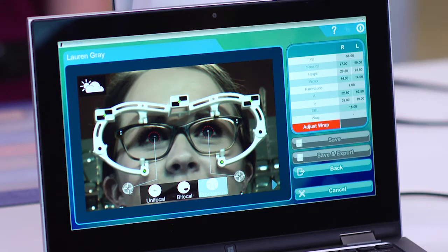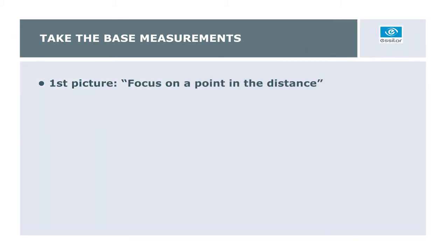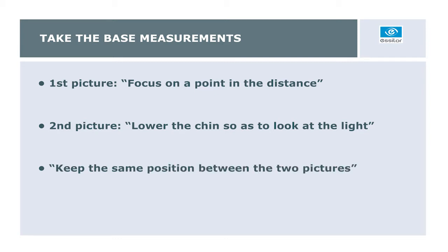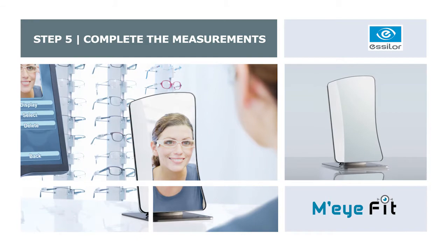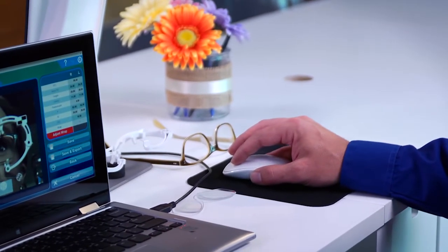Now I've taken the two pictures that we need for measurements, but I just need to make a few adjustments to get all of the measurements. Once you've taken the two pictures, the patient can remove the frame and clip. The last step is to complete the measurements by checking the iris detection and corneal reflections, completing the boxing, and if necessary, measuring the curve of the frame.